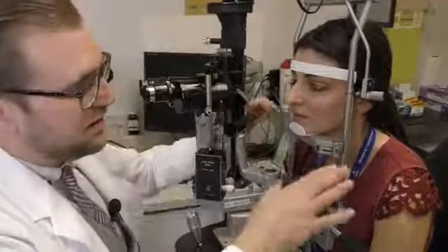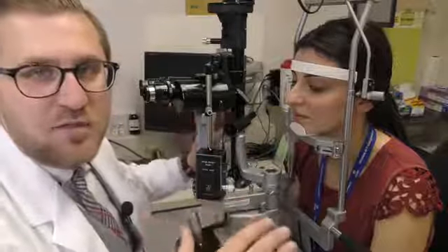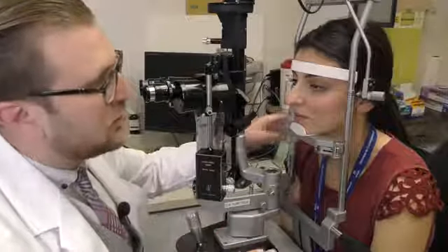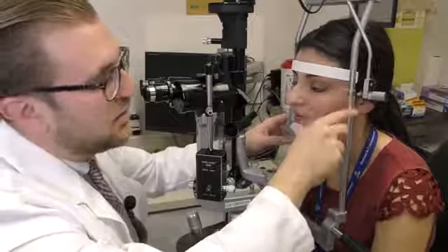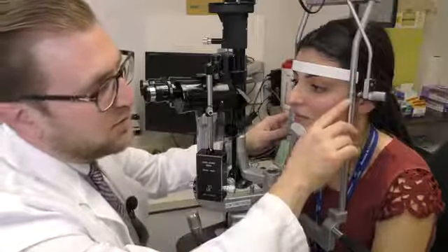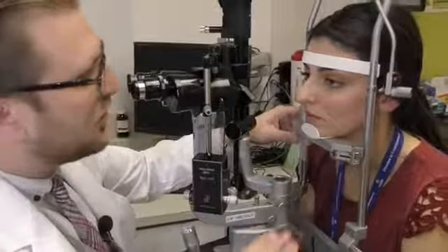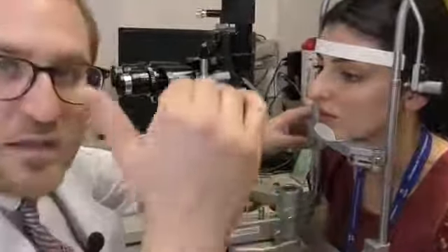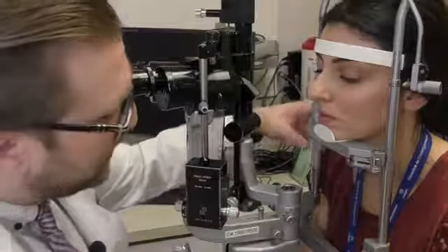Okay, now that we have the patient in position, we want to do some fine tuning to make sure that you're ready for the exam. So next I want to make sure the patient's at a good height in terms of her chin and the marker. So here's the lateral canthus marker. You want to make sure the black marker is in line with the lateral canthus, which in this case looks pretty good. What I can do is bring the whole machine, the whole chin rest, up and down by turning the knob here.